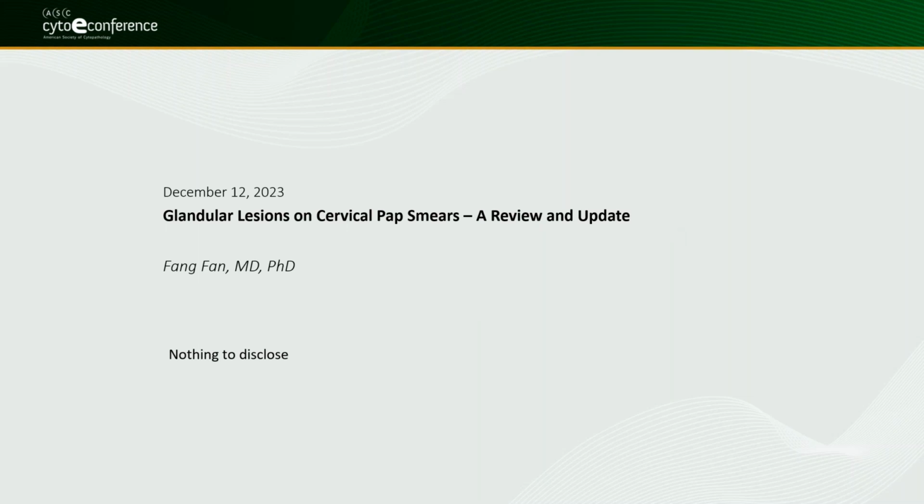And so today we're going to talk about glandular lesions on cervical pap smears.